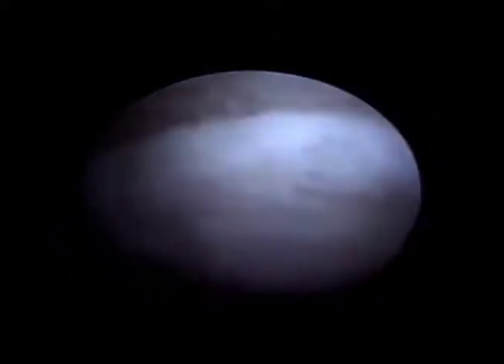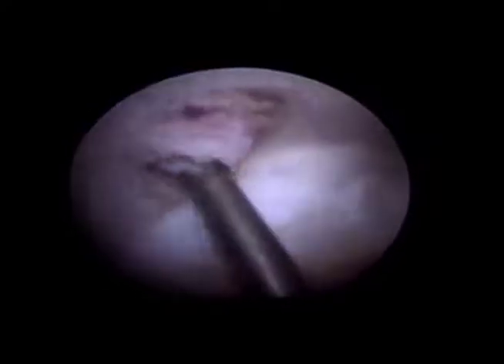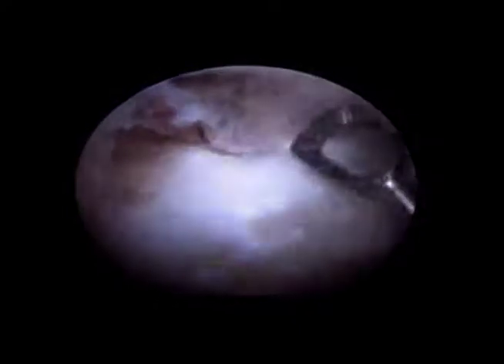Here the lesion demonstrates punctate hyperemic fibrous tissue typical of an osteoid osteoma. A rim resection has been completed on our approach to the lesion. A ring curette is used to precisely excise the lesion. We continue the resection until we are able to observe normal cancellous bone circumferentially around the initial lesion location.